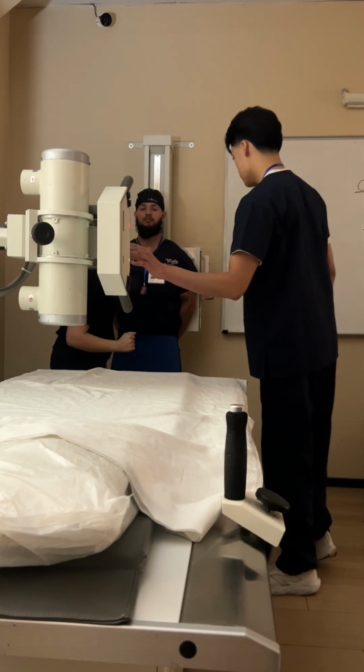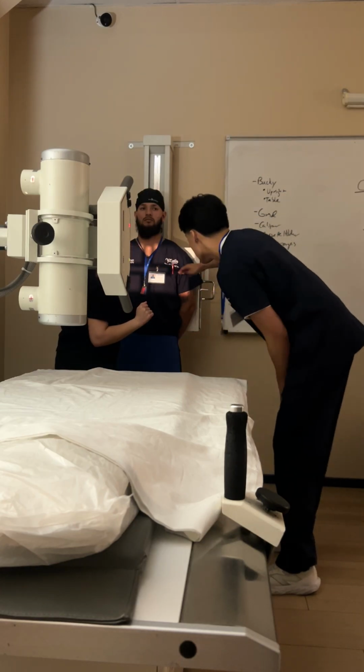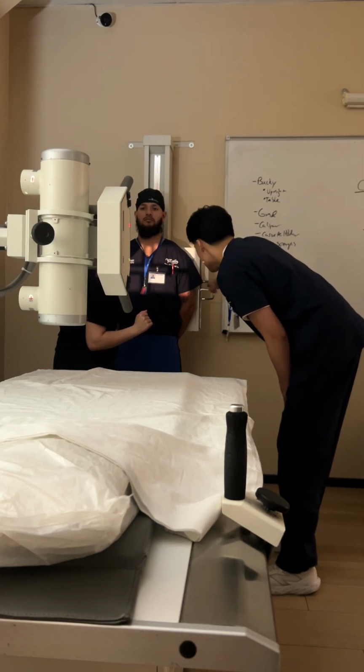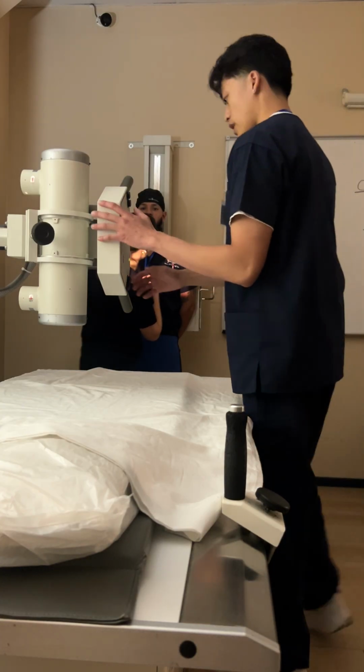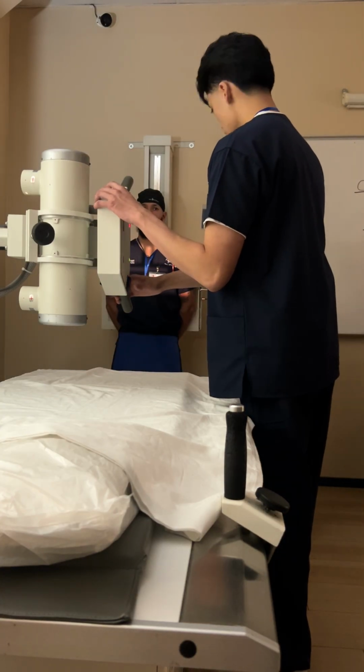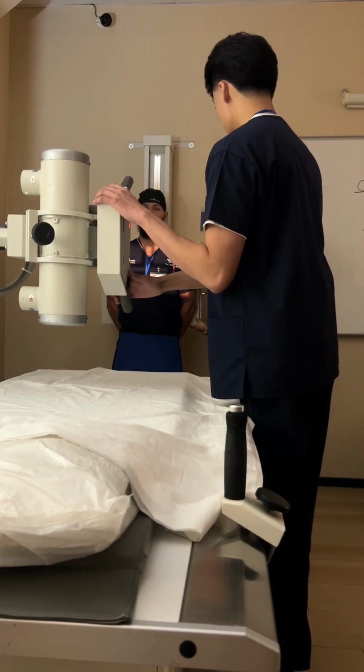And then for the trim part, how far out? Just about right here. Okay. Would you have them do that before or after? Usually, when you put them in position, they will automatically go that way, because otherwise their face will be right into the bucky.